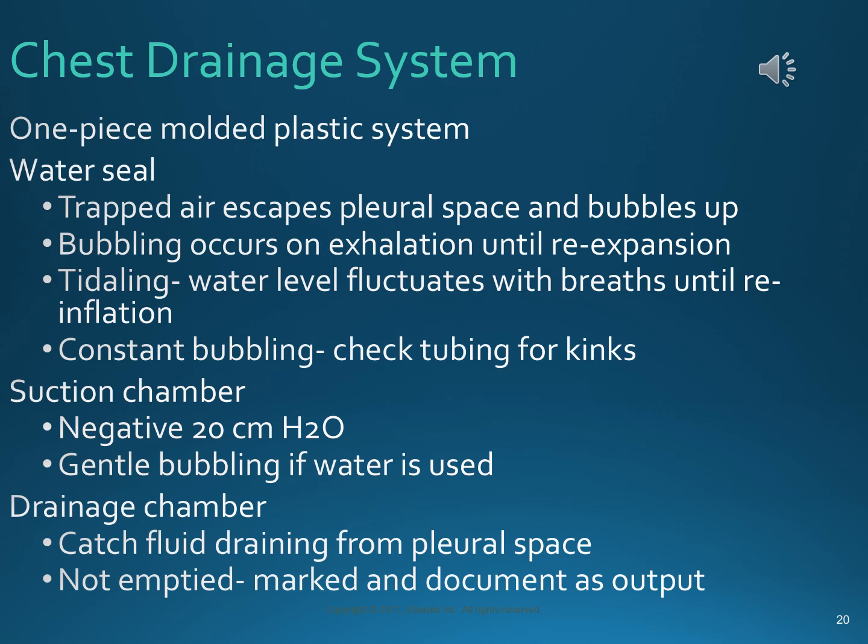This is something that you probably won't see right now while you're practicing as an LPN, but for whatever reason, it seems like there's always questions about this on ATIs and on NCLEX practice questions. I don't know what you'll get on the NCLEX. So anyway, I feel like I ought to go over it, but I don't think that this is all that important for your practice once you graduate. So anyway, there's 3 chambers.